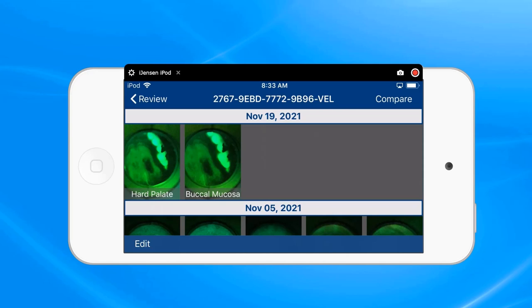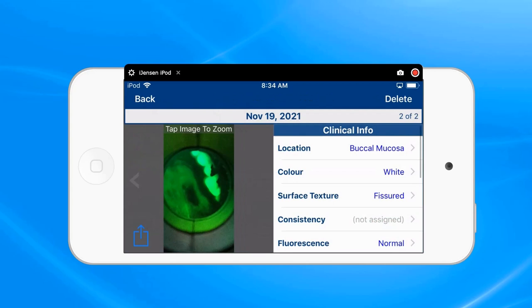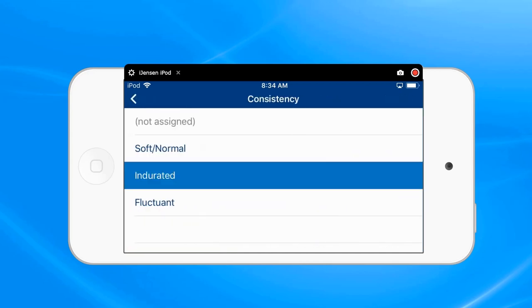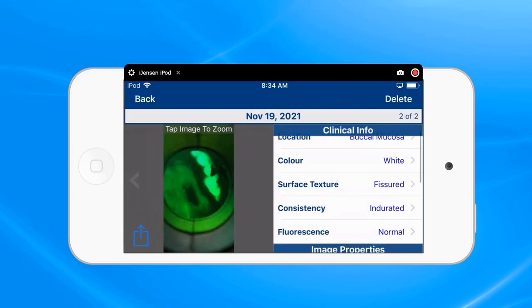So let's just say that we want to transfer the latest image and we'll just put buccal mucosal. You can always add information if we so desire if we did not put it in there previously. At this point, we have two options of how to transfer that image.